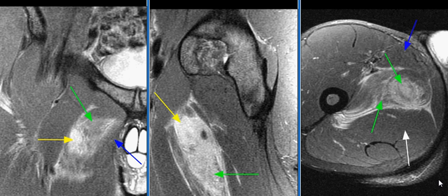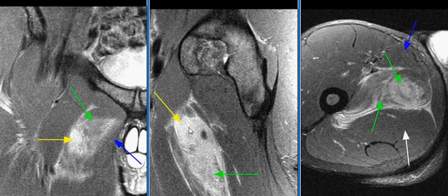This patient is a professional dancer with injury to the right groin. MRI examination of the thigh shows T2 hyperintense edema, fluid, and hematoma in the adductor brevis muscle, consistent with a high-grade 2 to grade 3 strain with tearing of the muscle fibers, 2 to 3 cm distal to its inferior pubic ramus origin.